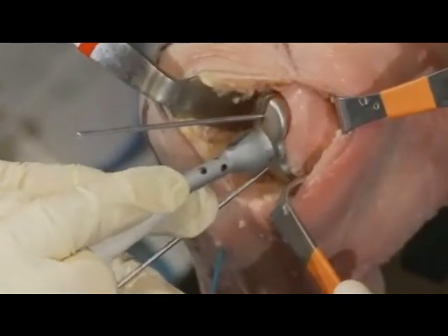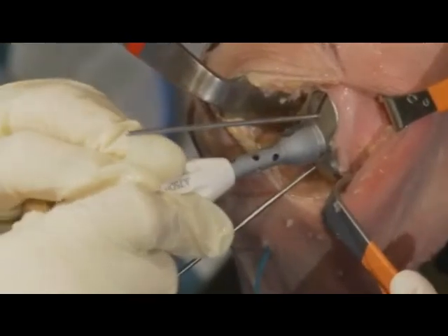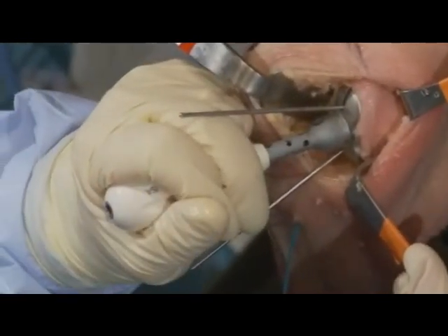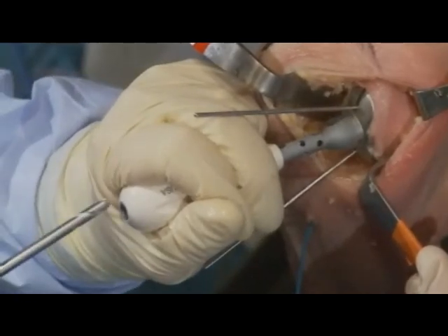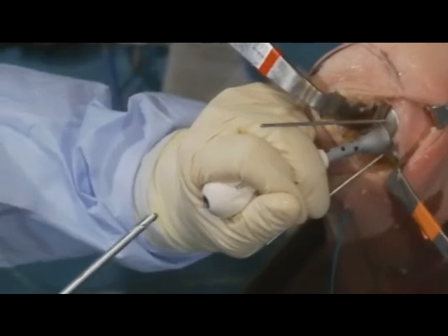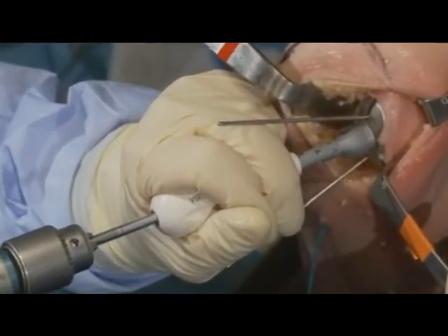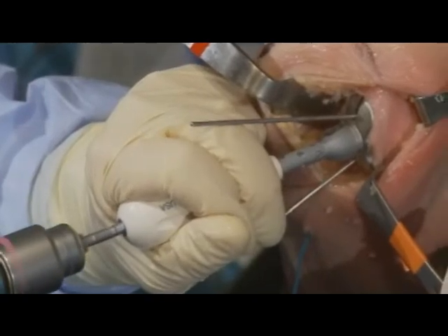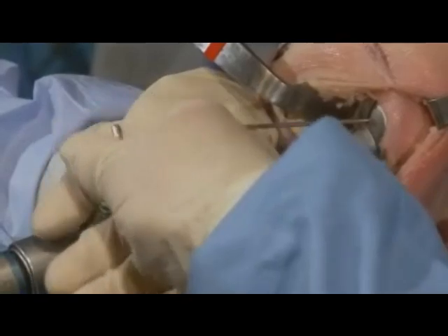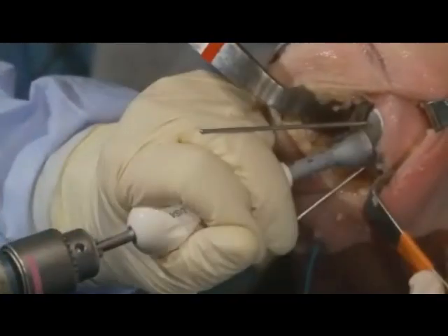You have your wires in there to set up your alignment, and then we put it in position, and you can see that we have a pretty good fit from an anatomical standpoint. So once we get our fit, we put this drill down the center, and this point here is the critical point because you can always change the position of this implant up until now. Once you put this in, it's down to the laser mark. Chuck key, please. Now you're set in terms of the axial alignment of your femoral implant. Okay? So we have that.